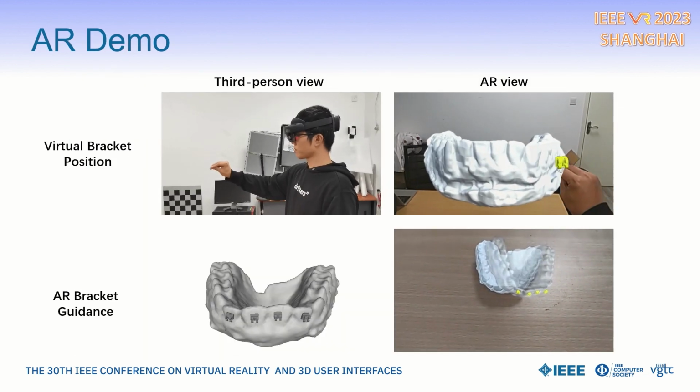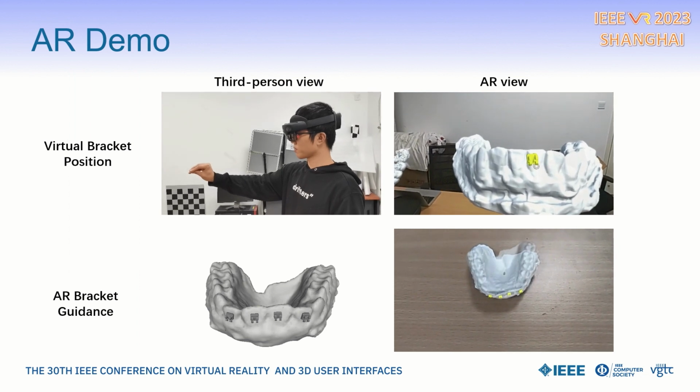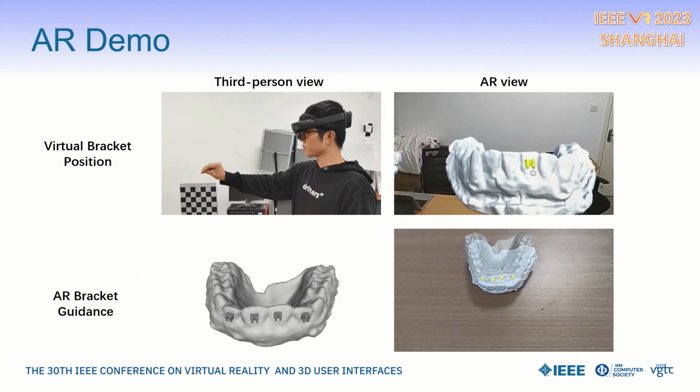We show some AR demos for virtual bracket position and AR bracket guidance from third-person view and AR view.